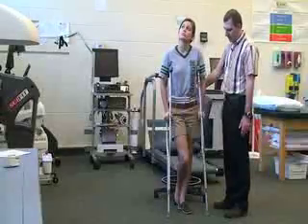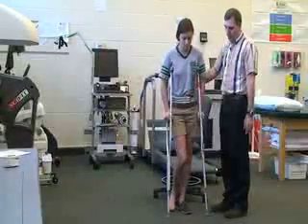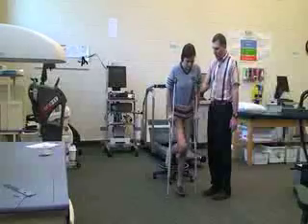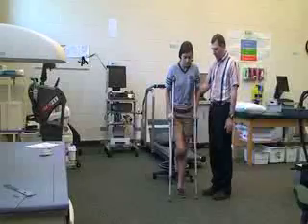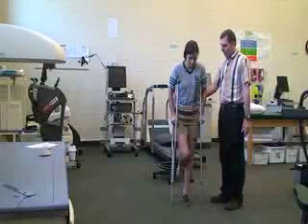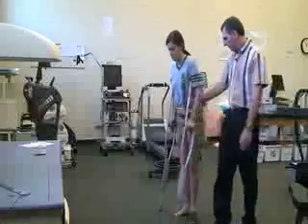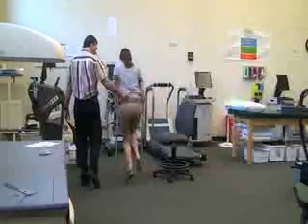Next we're going to have Katie do a three-point gait pattern. She's going to bring the crutches forward while I'm holding on to the gait belt in the back, and then bring the good foot to the crutch. The injured foot is non-weight bearing at this point. That's a swing-to pattern. Then for a swing-through, she advances both crutches at the same time and swings through with normal gait. Crutches forward, swing through — crutches forward, swing through.